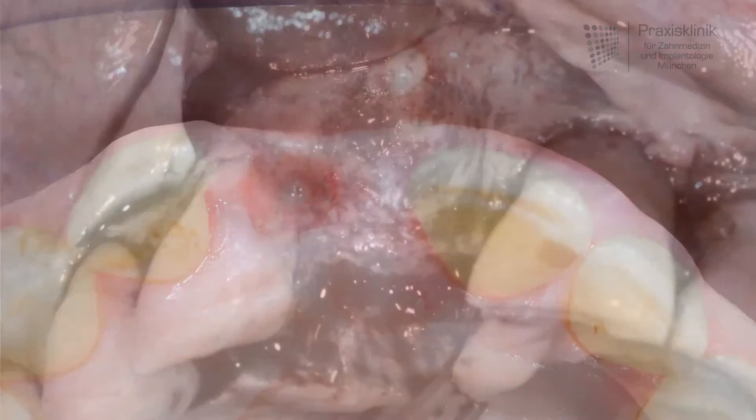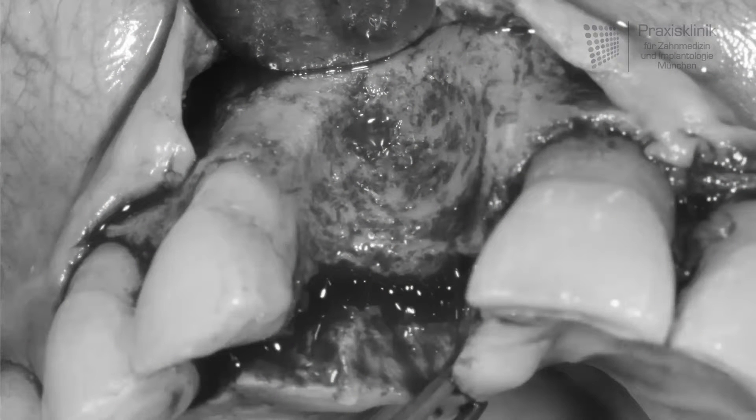After elevating the flap we can see the huge dimension of the defect in the bone, here marked in the red area.